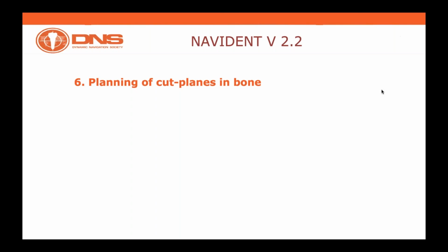And of course, we need to document and demonstrate the feasibility of that. I know that Dr. Bouget, Dr. Stefanelli, and other colleagues are working towards that direction. I know also Professor Volkan Harrison is working on applying that feature to smile design, because that is equally a quite compelling proposition.